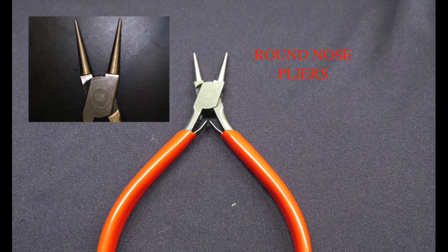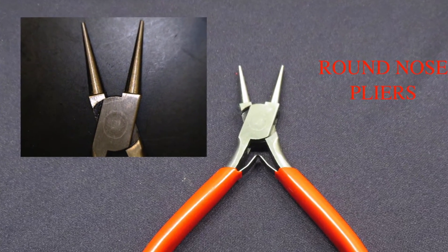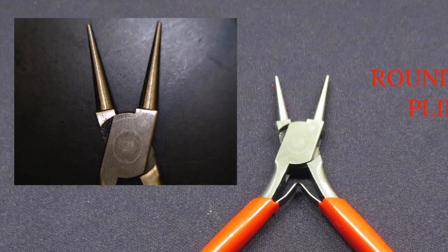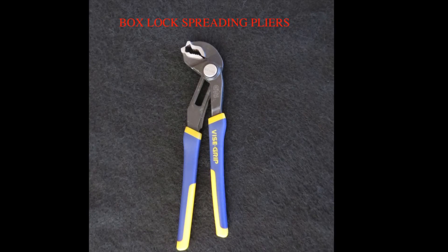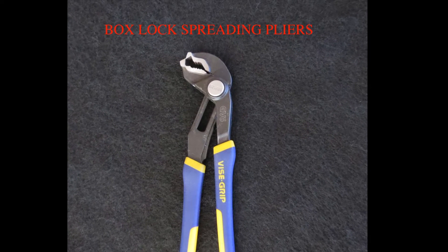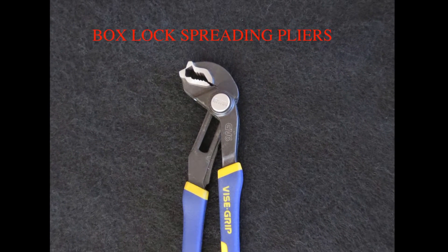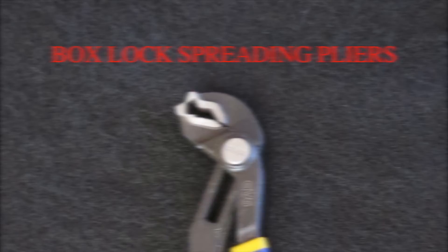Round Nose Pliers: These pliers have two cone-shaped jaws that are used to restore the curved tips on skin hooks and small rake retractors. Box Lock Spreading Pliers: These pliers are adjustable and have two specially designed jaw teeth that are used to spread the stiff box lock after instrument milk lubrication does not eliminate the stiffness.